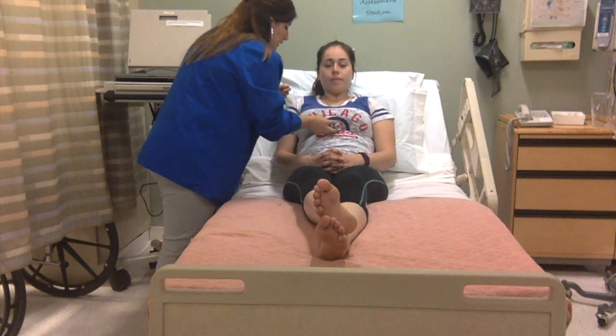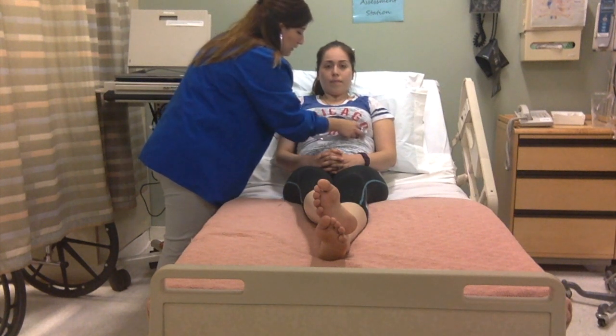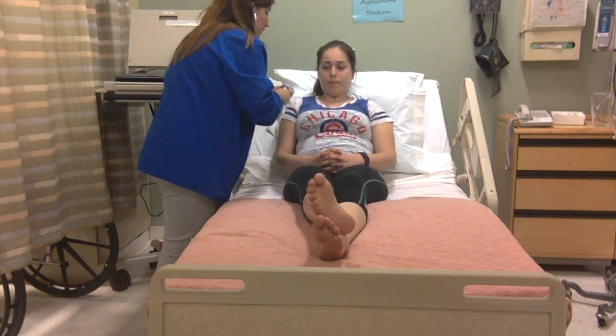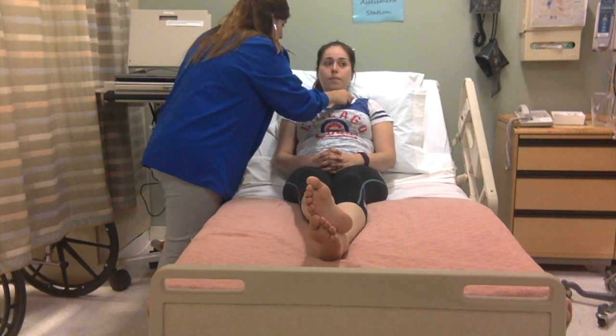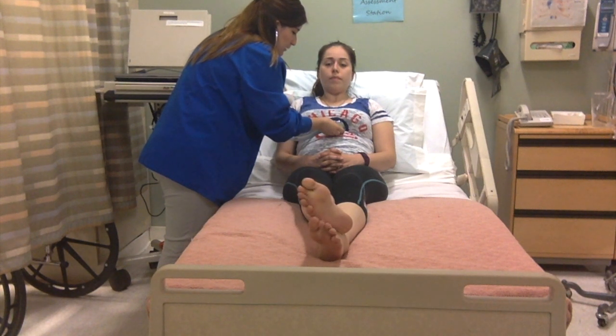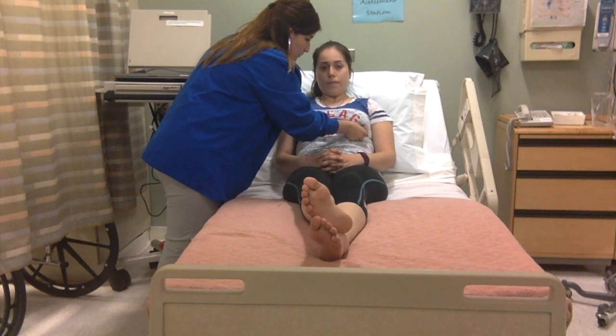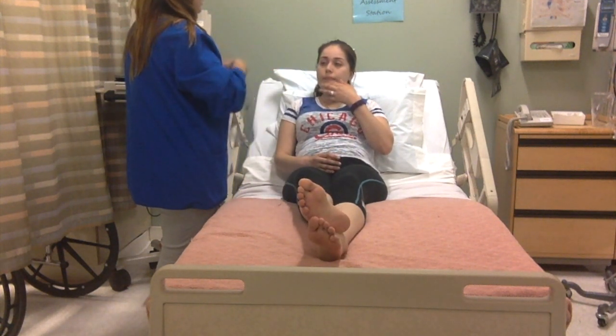Okay, S1 and S2, and then it'd be tricuspid. Okay, S1 and S2, and then the mitral. Okay, S1 and S2, and then I would do the same with the diaphragm of my stethoscope. Let's say aortic, S1, S2. Pulmonic, S1 and S2. Okay, tricuspid, S1 and S2. And then the mitral, S1 and S2. I didn't hear any extra murmurs, clicks, or sounds.